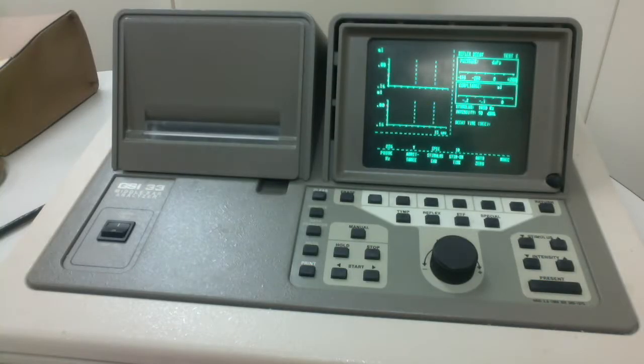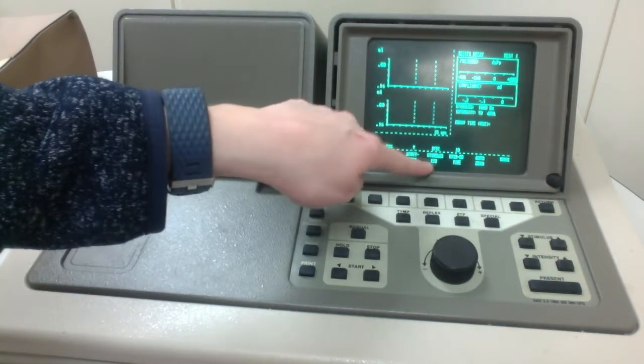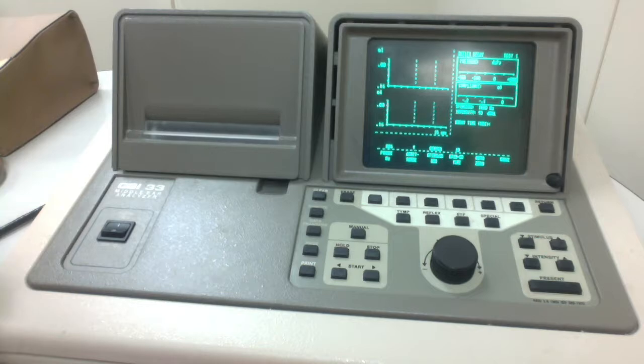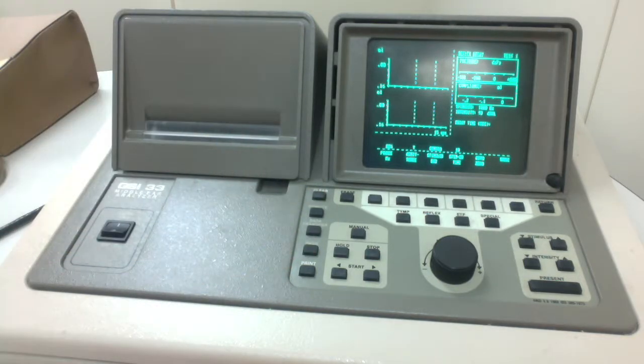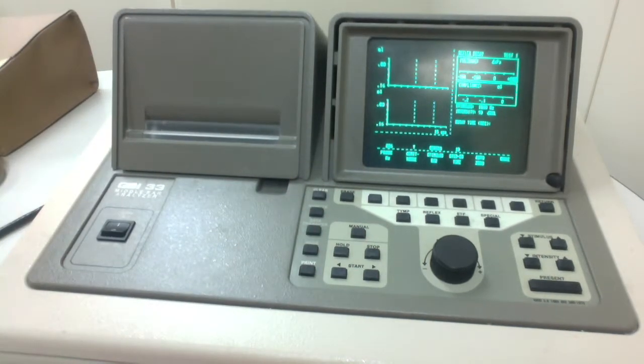You can change on here which stimulus ear you want, ipsilateral or contralateral, by clicking that. I'm going to change it to contra, because that's the test that I'm going to do. So I'm going to put the contralateral attachment, so this would be the stimulus, into my right ear, and then I'm putting the probe tip into my left. This is what we call a right contralateral decay, because it's always based off of which ear is being stimulated. So I'm putting that into my right, putting this into my left, and then we're going to run a test, or try to run a test, I guess.